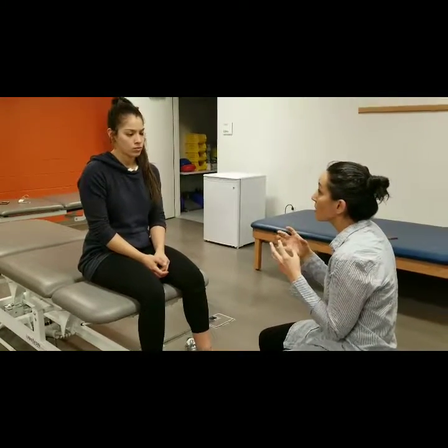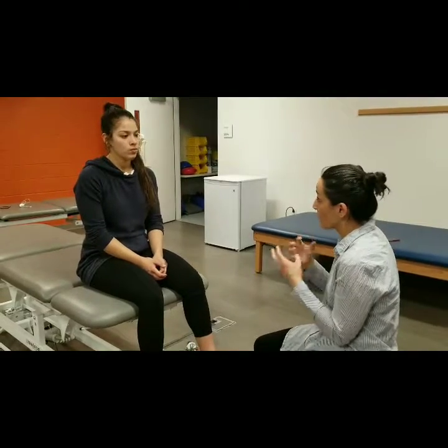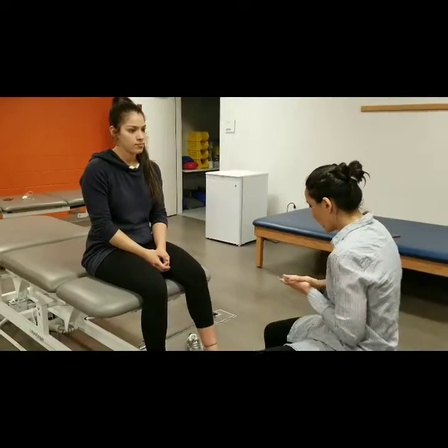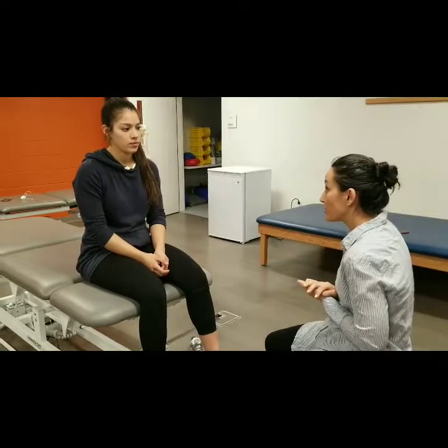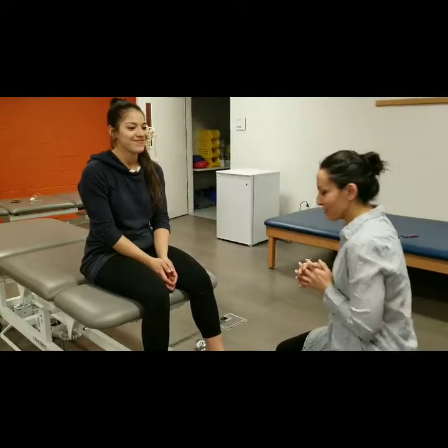It shouldn't feel like a lot of pressure bothering you too much. It shouldn't feel like it's suffocating your ankle. So is it okay if we put the bandage on your ankle? Sounds good. All right, thanks.